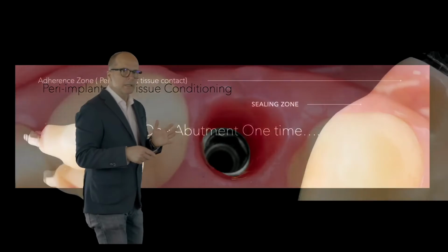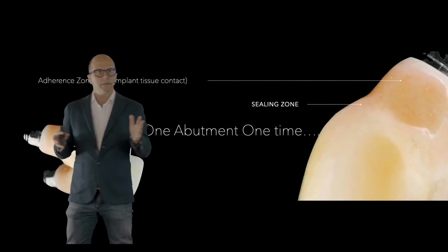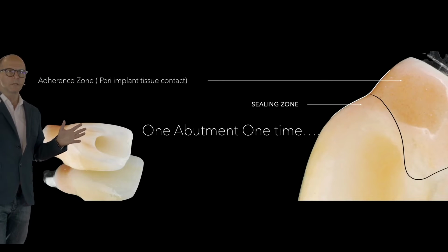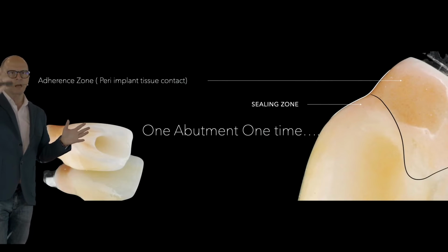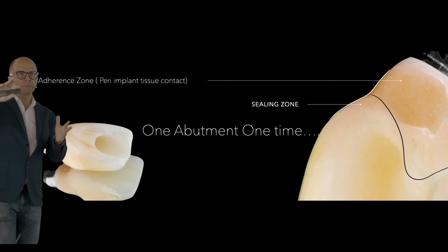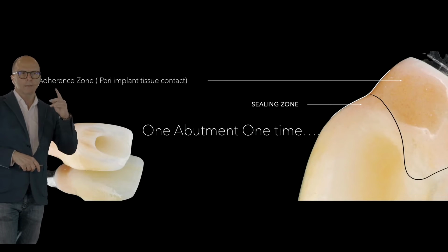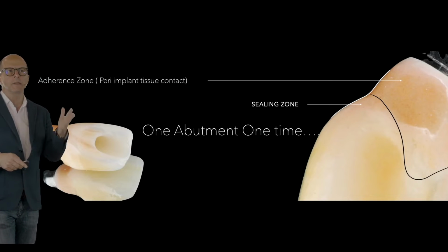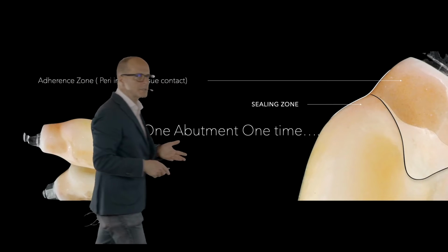Then comes the time for the final crown. And as you can see in the slide, we have two different levels: the adherence zone, where I have the peri-implant soft tissue contact, and the sealing zone, where I have the plaque zone, which are the subcritical contour and the critical contour. And the question is, what about the one abutment one time? Do I really need to work and think like this?